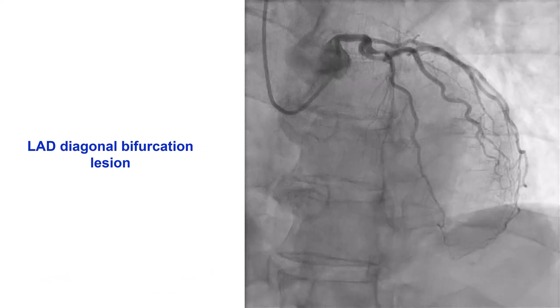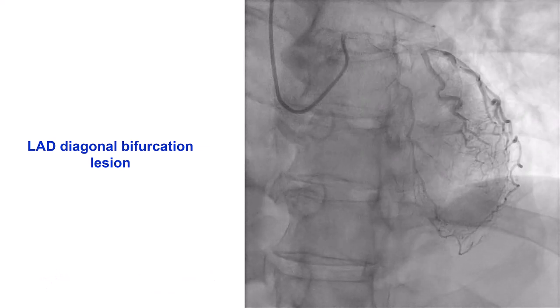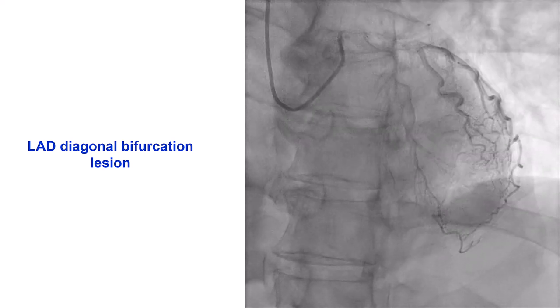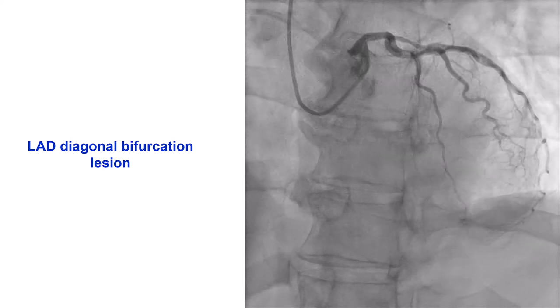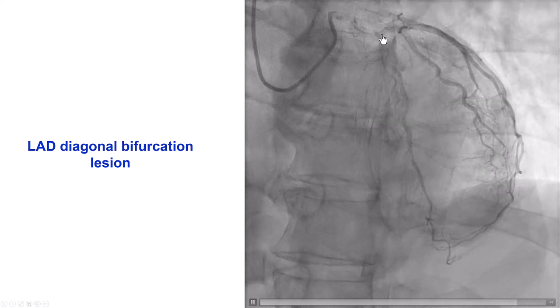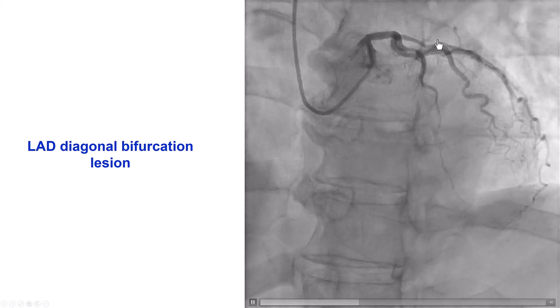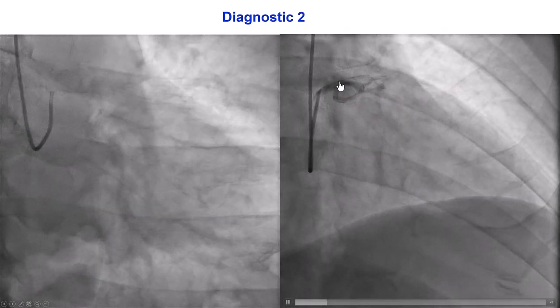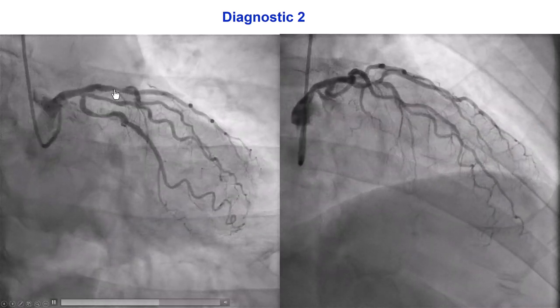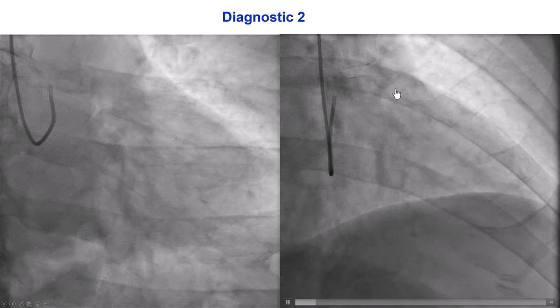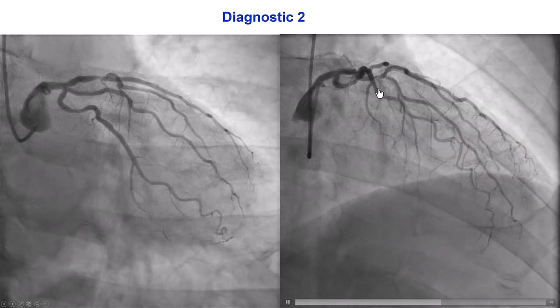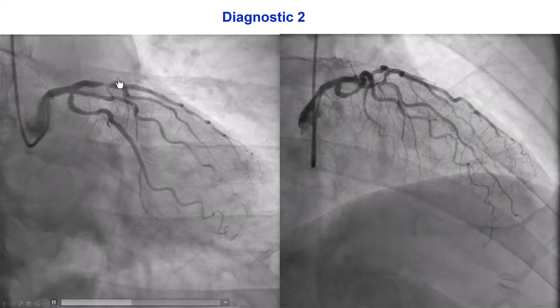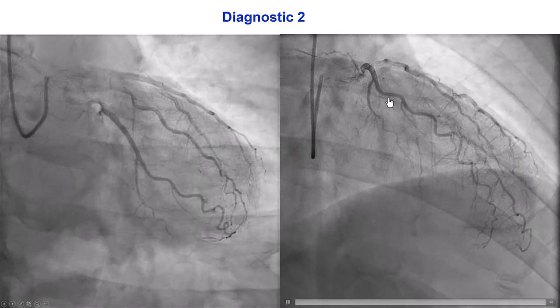The patient presented with stable angina and was found to have ischemia on the anterior wall on stress testing. Diagnostic angiography demonstrated a bifurcation lesion in the proximal to middle LAD at the takeoff of a large diagonal branch. It was actually hard to optimally visualize this lesion, but the worst stenosis was proximal to the bifurcation with some stenosis distally and about a 50% stenosis in the origin of the large diagonal branch.